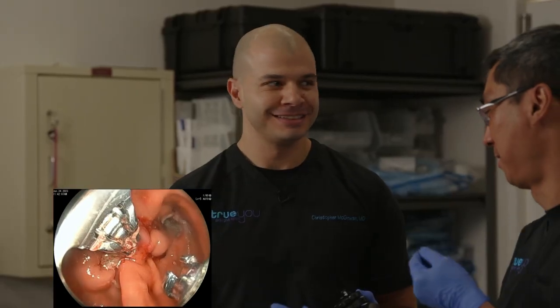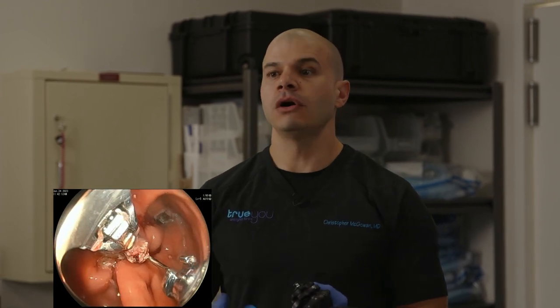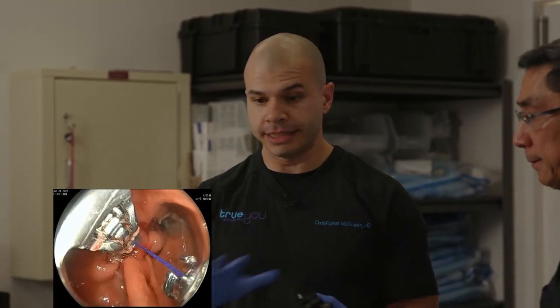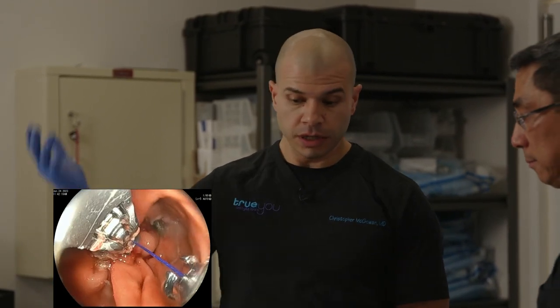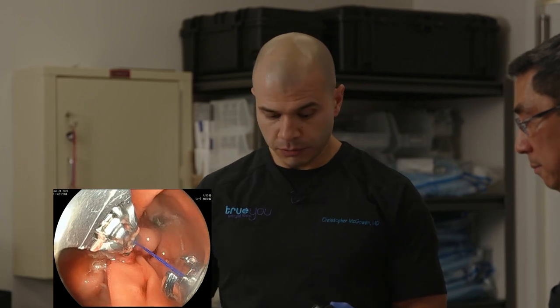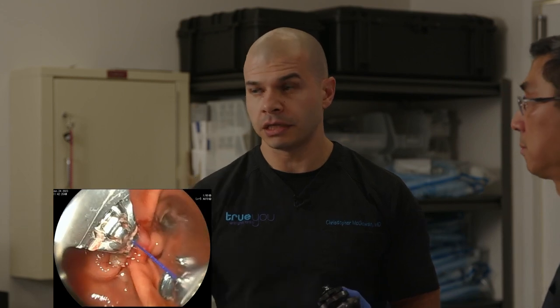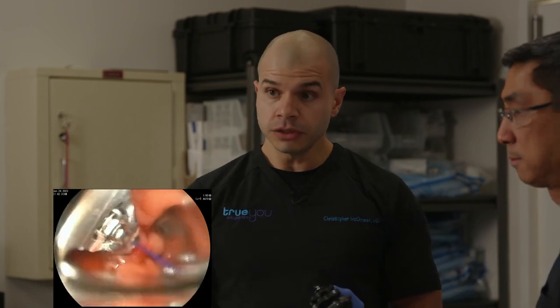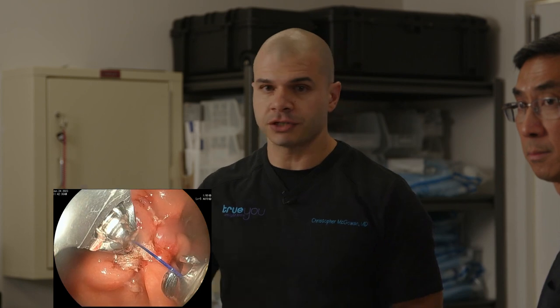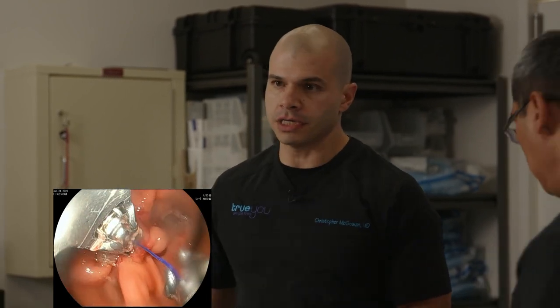Camila on Facebook wants to know, do you stay overnight after the procedure? Maybe speak to folks that are coming from across the country? Oh, for patients traveling. Well, first of all, you do not stay overnight. You go home after this. So our patient will wake up from the procedure, recover for an hour or so. Once she's awake, comfortable, taking some sips of liquids, we'll let her head home. Now, she's actually from out of state. She'll head back to her hotel, stay overnight nearby, and then we'll see her tomorrow morning for follow-up. That's really important. So we'll make sure she's recovering well. We'll provide some extra IV fluid so she can just kind of relax and not feel like she's forcing liquids in. And then we can say, okay, you're safe to return home.